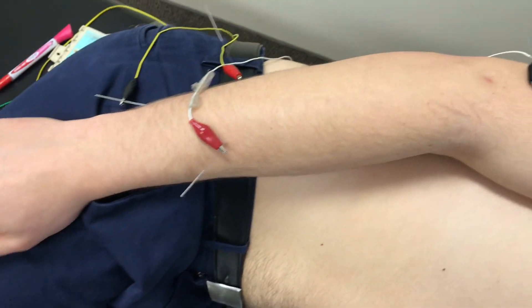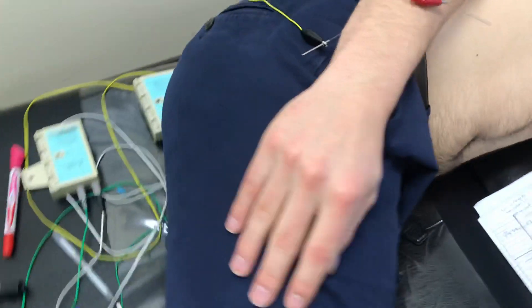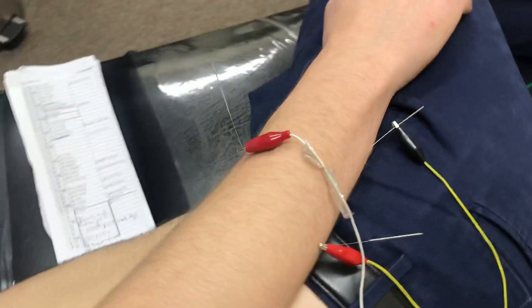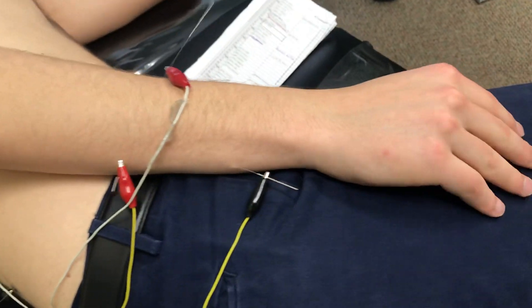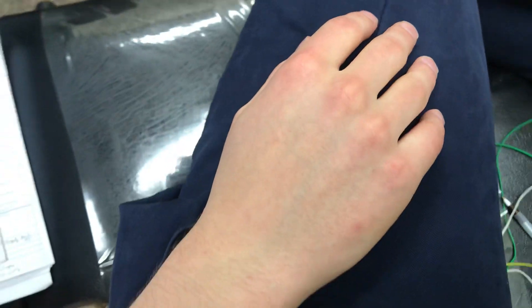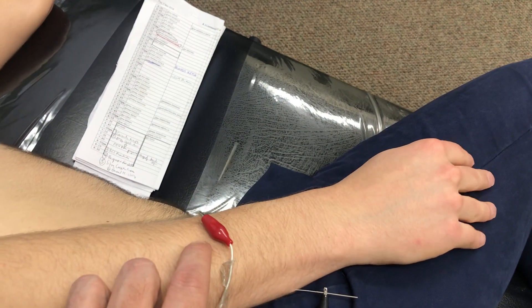I'm going to break this down for everyone. As you know, with Elijah's non-freezing cold water injury, we're working the intrinsic muscles of the hand and the deeper nerves of the arm. I have offsetting frequencies — the first is here in the extensor pollicis, specifically stimulating the deep radial nerve.